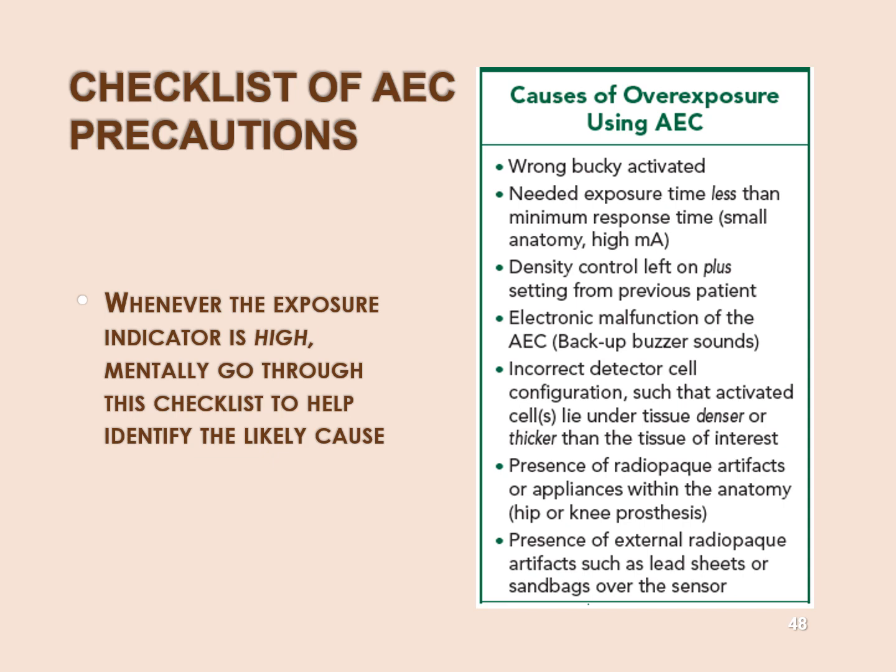Electronic malfunction of the AEC. It's an electric device, just like anything else. Does a light bulb ever blow out? Does a capacitor ever blow out? Does an ion chamber ever blow out? Yeah. Does a thyratron ever fail? Yeah, all those things can happen. So your AEC might fail. If you've been using the AEC and you notice that you just keep hitting the backup timer, no matter what size your patient is, yeah, you might want to call Biomed.